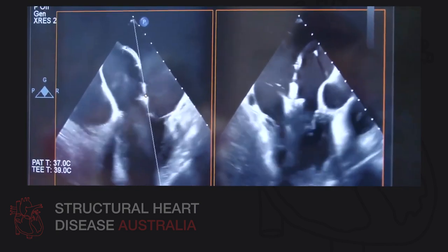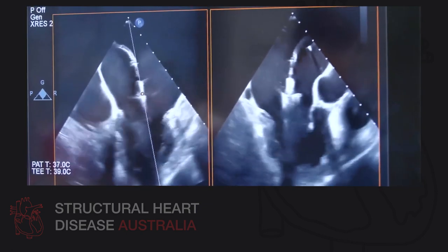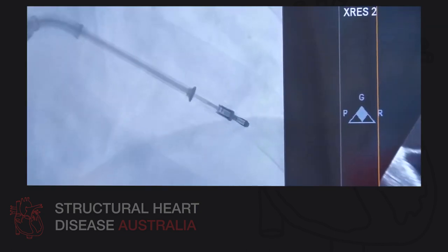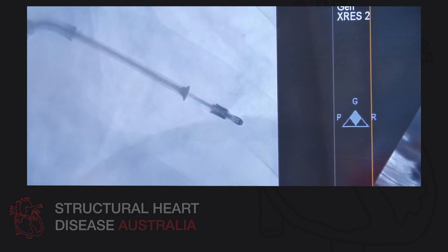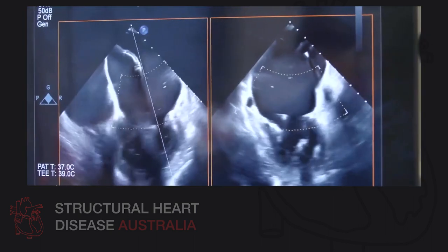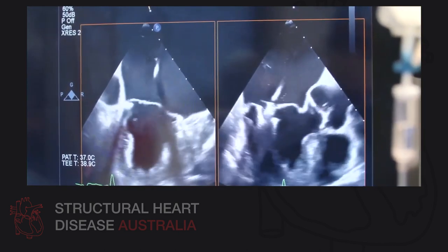We'll try and go into the ventricle here, right? So if you stay in that view, we'll cross the valve. If we look on the X-ray, we look exactly side on to the clip, which means that we probably have not rotated that much. And there's a slight aorta hugger slant on the LVOT view. Going from anterior to posterior doesn't help me.